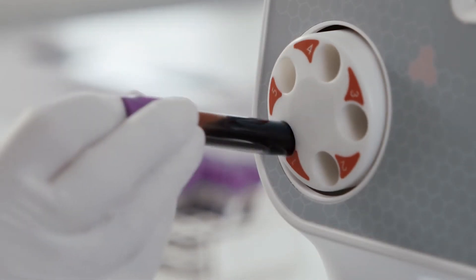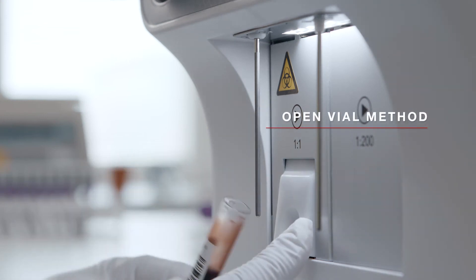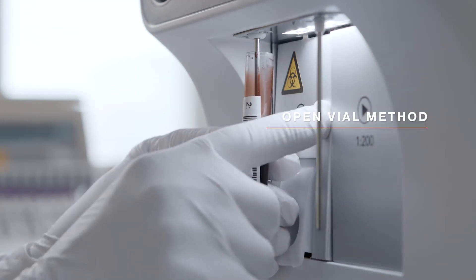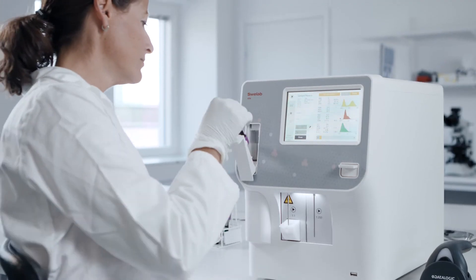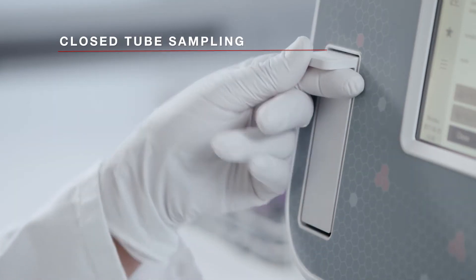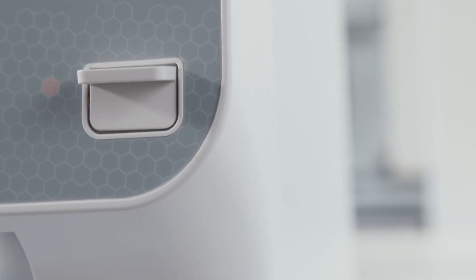Swelab Alfa Plus gives you the market's widest choice of sampling options. Sample whole blood using the traditional open vial method, or choose the increased safety of closed tube sampling that cap piercing provides.